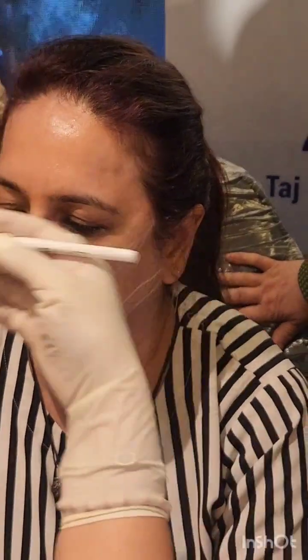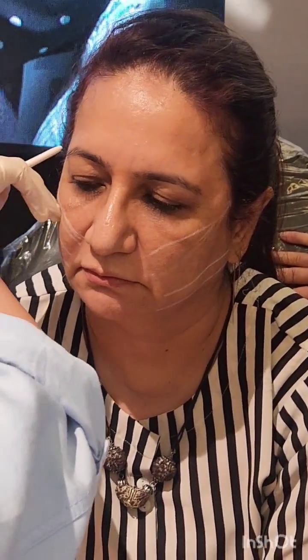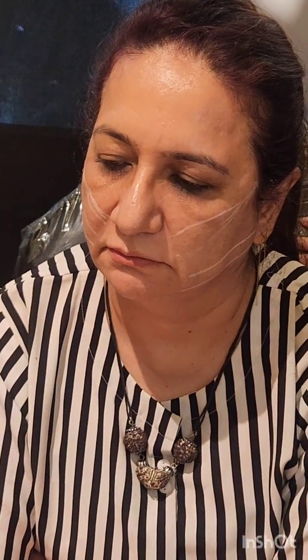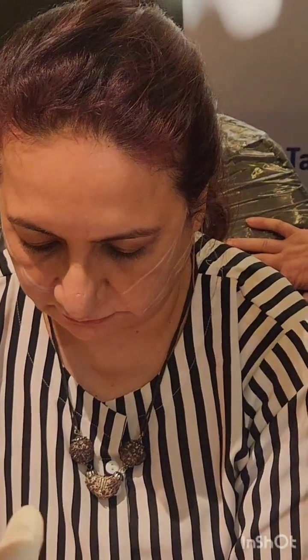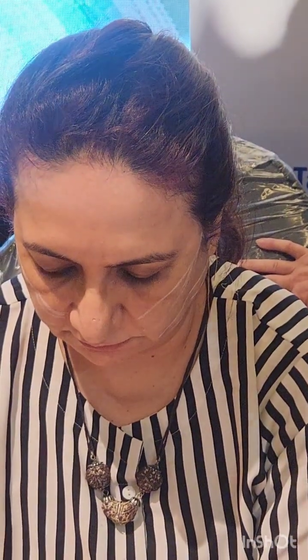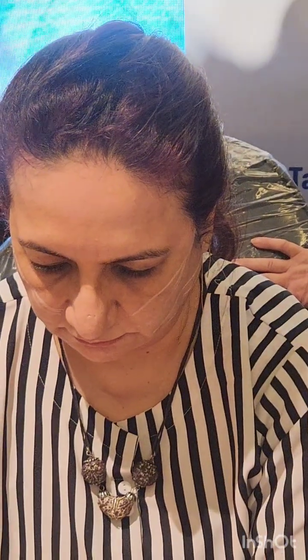Just around the previous, anywhere. Okay, got it? With the cogs. Same. I'm talking about cogs. Okay. Yeah. Cross hatching also with the cogs. If you want to introduce more, if someone is 80s are coming, of course you cannot deny the treatment for them, right? There will be too much laxity for everything. So cross hatching helps. That creates a mesh kind of thing, and that helps to reposition the tissue more efficiently.